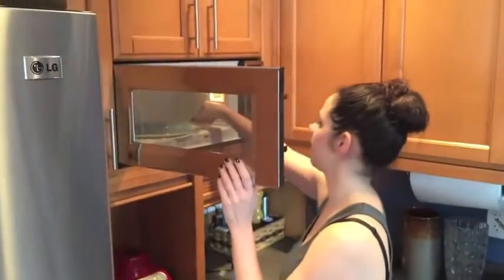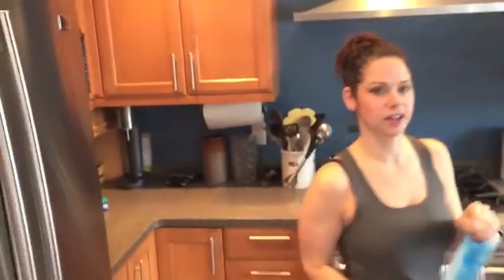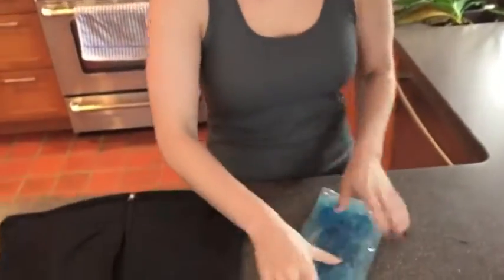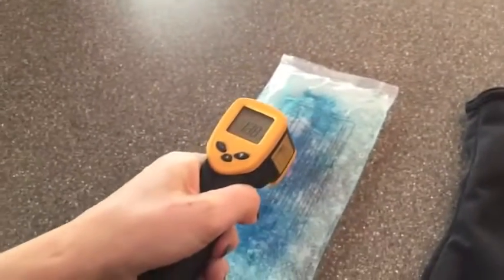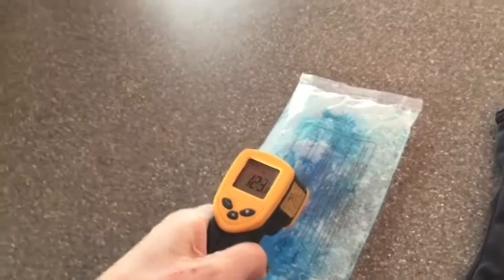Okay, so our therapy pack is ready, and just to illustrate the temperature I have a heat gun right here, and we are looking at about 120 to 124 degrees Fahrenheit.